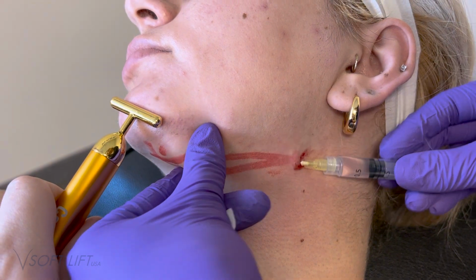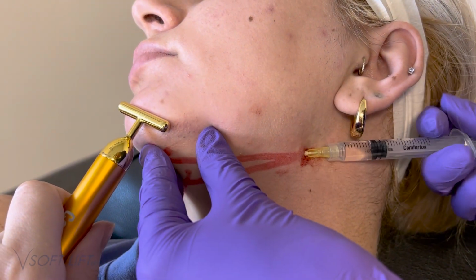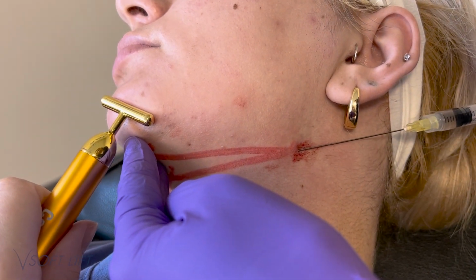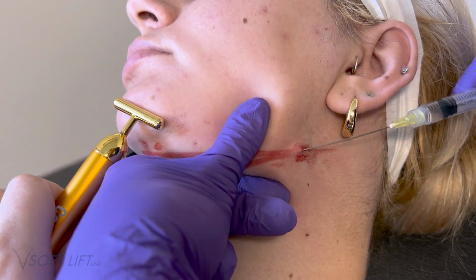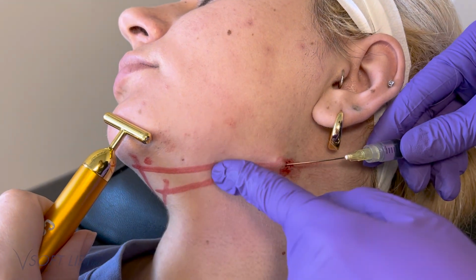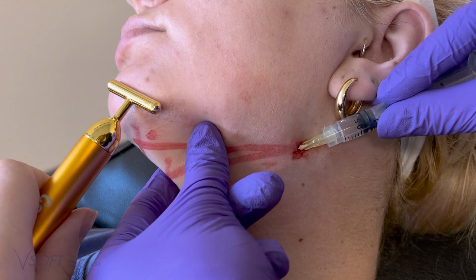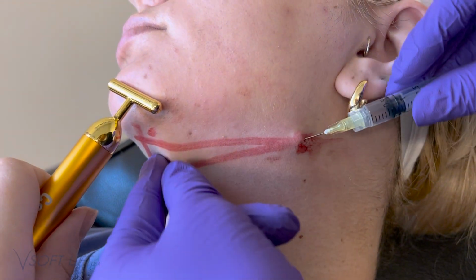And here I am going in making the track that I want with lidocaine. This is 1 or 2% lidocaine. I don't give epinephrine in this just because I don't like my patients to feel jittery, and there's genuinely not much of a need for it. When I numb just the porthole though, I do give lido and epi to vasoconstrict, and it's not a ton, so it shouldn't make them feel too jittery.